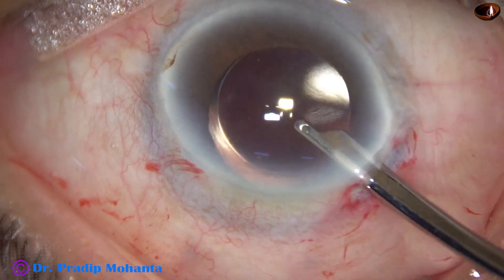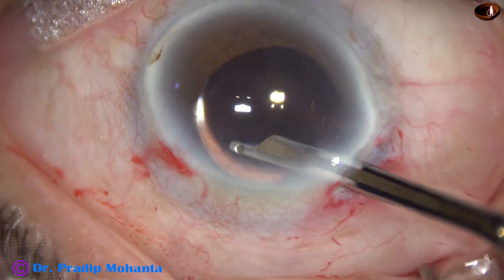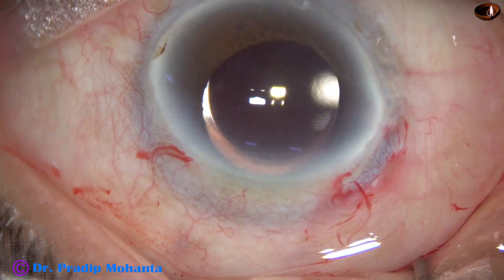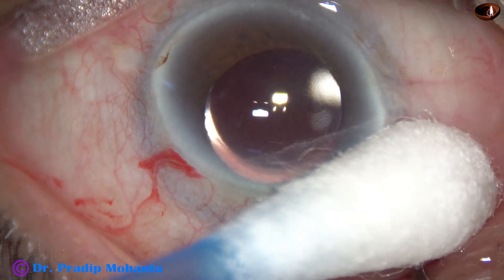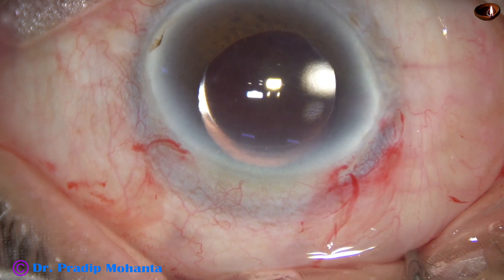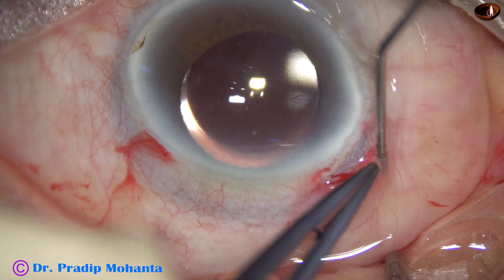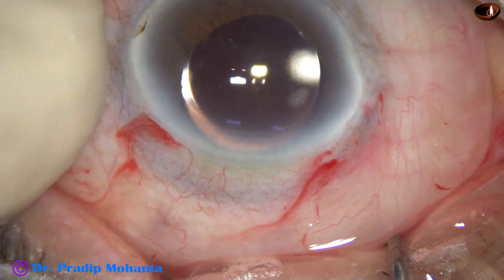And then lavage of the anterior chamber is done by the Simcoe cannula. The anterior chamber is formed in this way. And now I inject moxifloxacin subconjunctivally under the peritomy, and the conjunctiva comes forward.